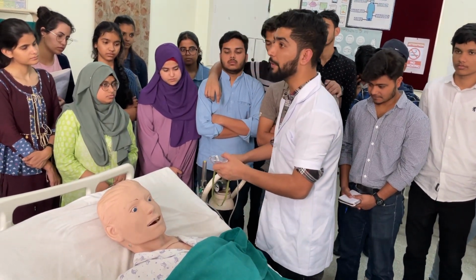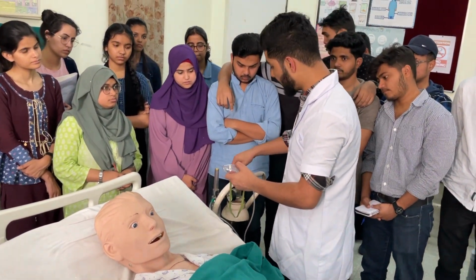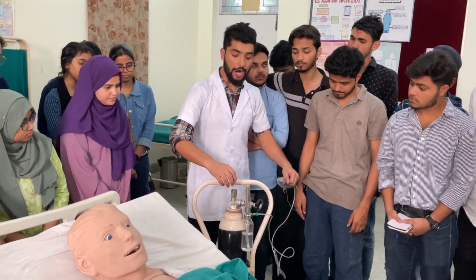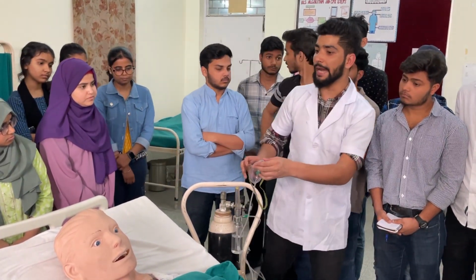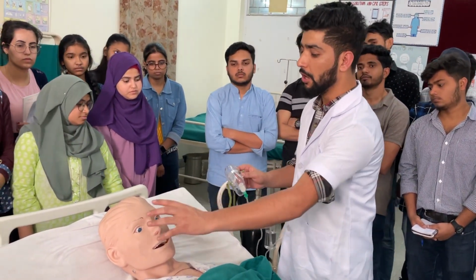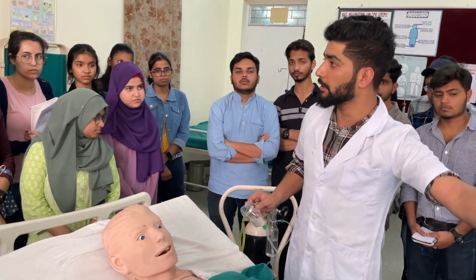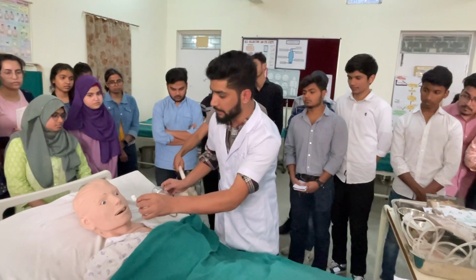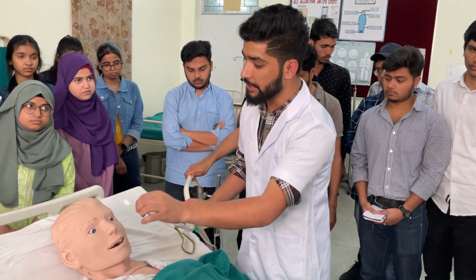Okay. After that, we have to turn on the oxygen cylinder in anti-clockwise direction. After turning on this oxygen cylinder, we have to check the oxygen supply on the hand. Okay. Before putting this nasal mask on the face of the client, we have to clean the nostrils by means of a swab stick. We have to clean the nostrils in circular motion.